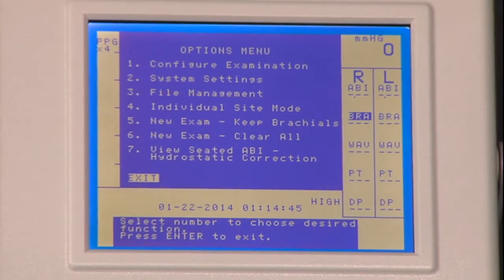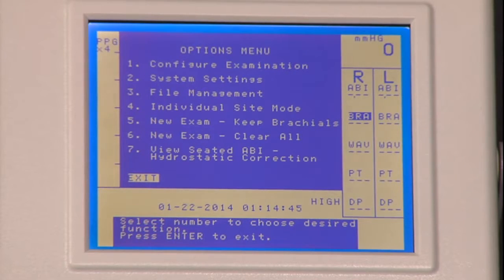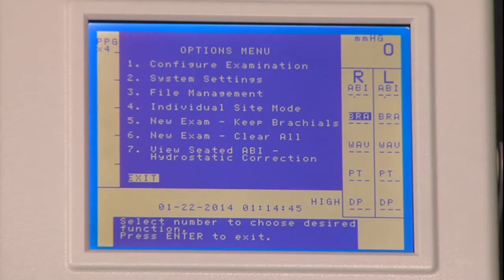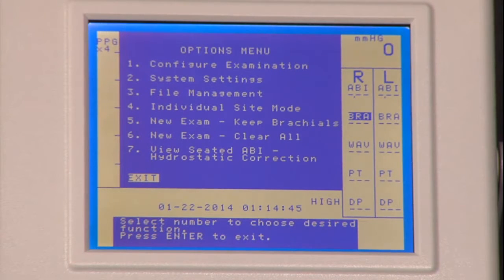Pressing the enter menu again to go back to the options menu. Number six — new exam, clear all — when you want to start a brand new exam and clear all of your previous data. And number seven — view seated ABI hydrostatic correction — used when performing a seated ABI requiring the hydrostatic correction. That completes the overview of the menu options on the Vista AVS system.